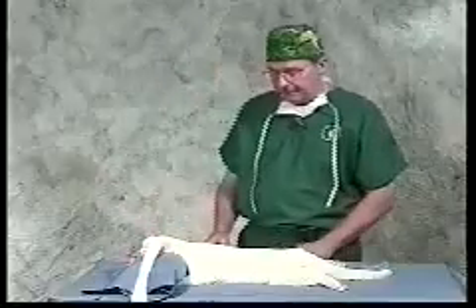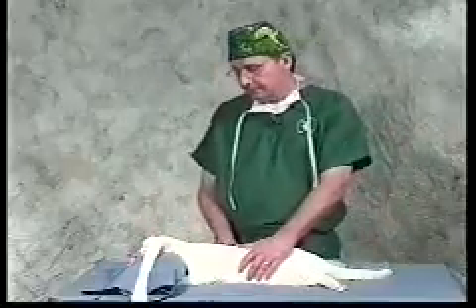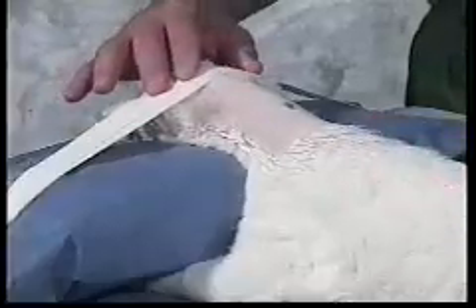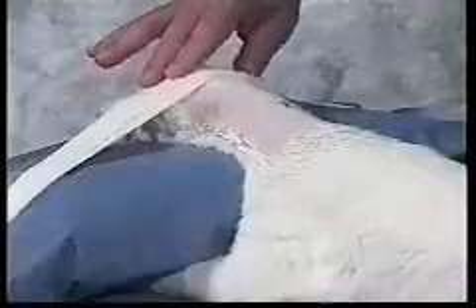Proper patient preparation is an important part of this procedure. We prefer to shave and surgically prep our patients prior to anesthetizing, because they are usually high-risk patients. In the surgery room, we prepare the patient by placing them in sternal recumbency with the head gently rolled over a towel and taped to the table. This will stretch the skin and allow for an easier surgical procedure.